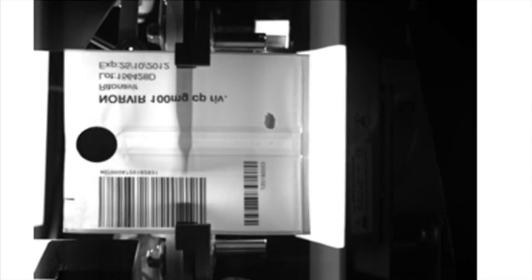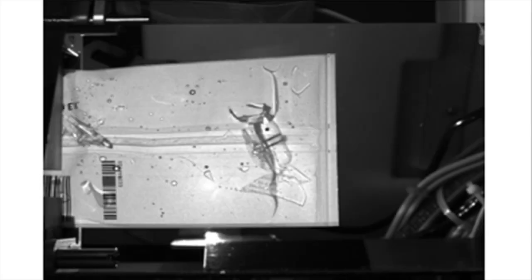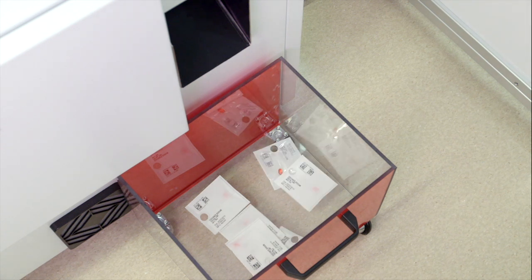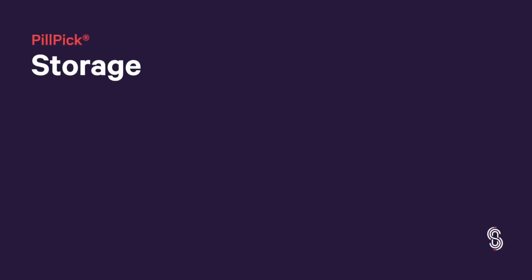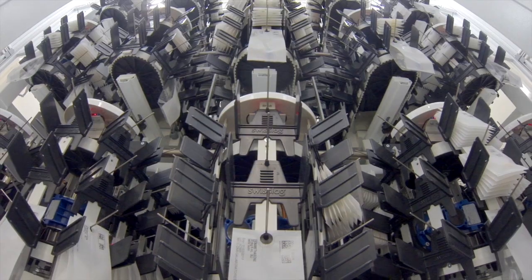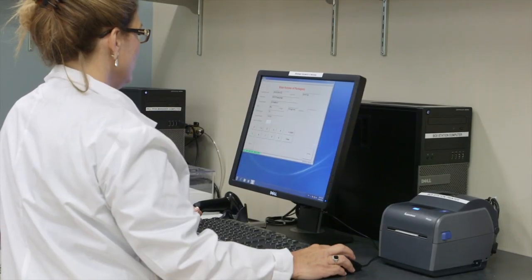Pill pick performs a secondary check of pill size and shape by photographing each bag. Damaged, crushed, or unexpected pills are discarded, and images are archived. A robotic arm transfers unit dose bags to storage until requested.